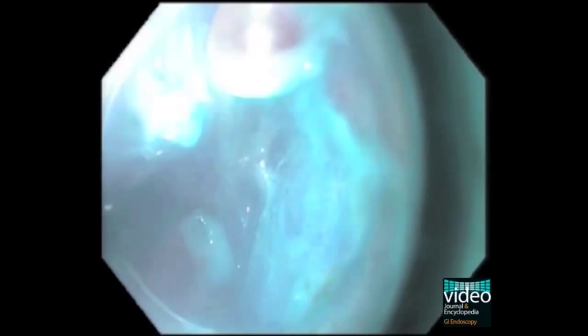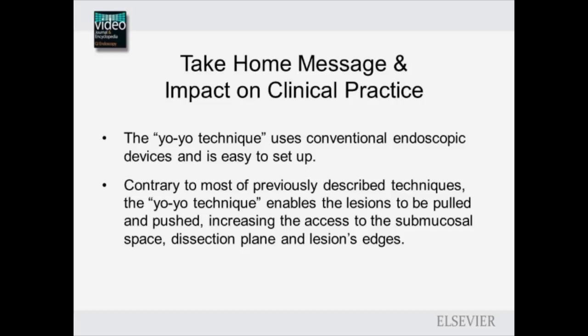The yo-yo technique uses conventional endoscopic devices and is easy to set up. Contrary to most previously described techniques, the yo-yo technique enables the lesions to be pulled and pushed, increasing the access to the submucosal space, dissection plane, and lesion's edges. The yo-yo technique improves ESD accuracy and safety, and may be used in different regions of the gastrointestinal tract.